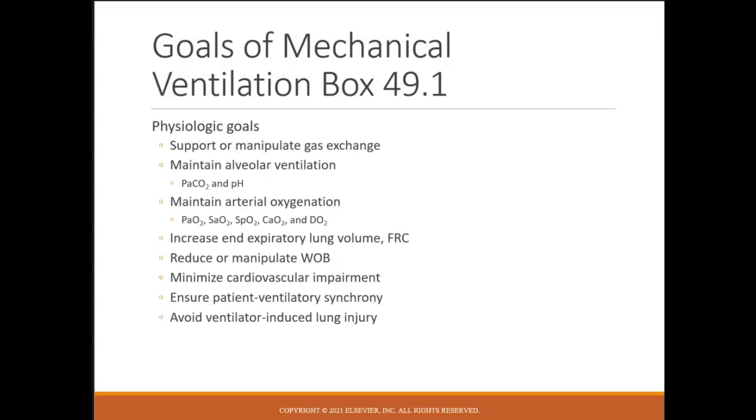We also finally are looking to reduce any ventilator-induced lung injury by minimizing those pressures that we're applying to the lung tissues. So we're going to be talking again a lot about plateau pressures. I'm going to include some discussion, new terms. I think you're ready for new terms about driving pressure and how that impacts or affects lung injury, like barotrauma in the patient's lungs.